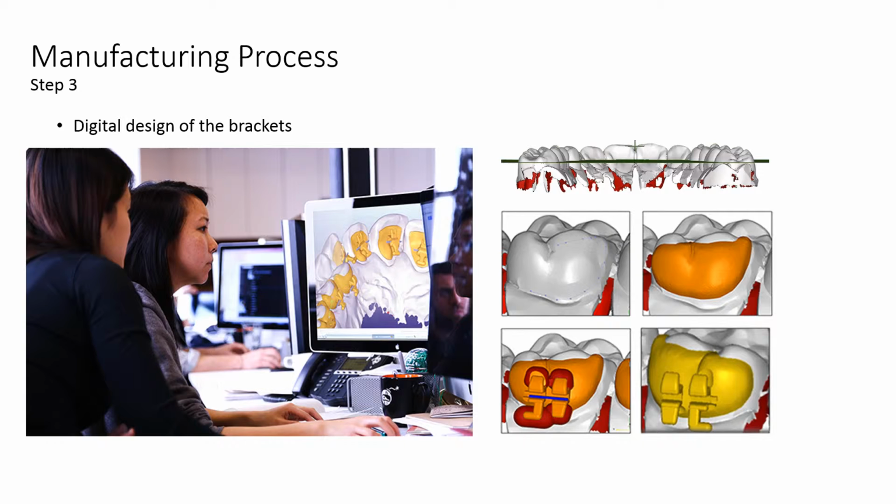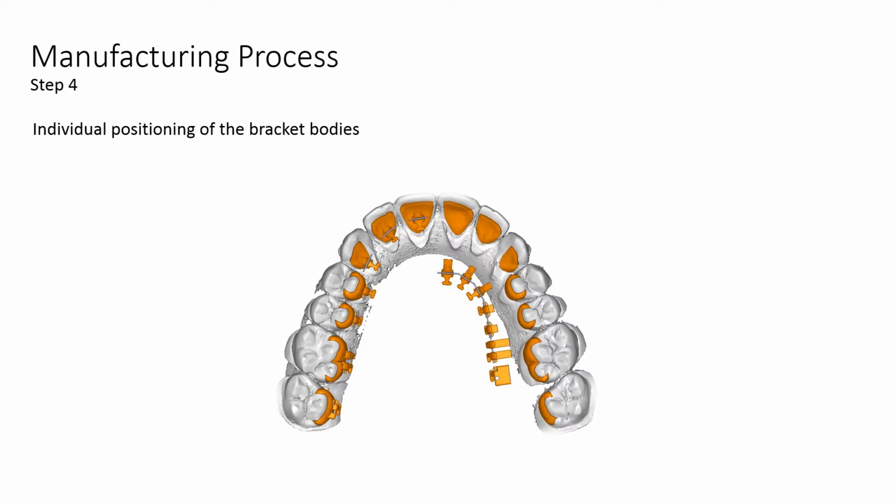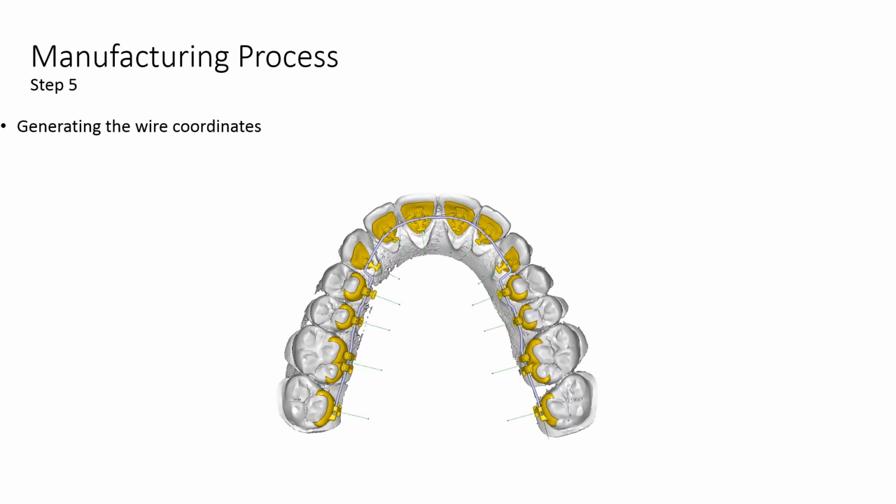You can get any kind of design because they will print it nowadays and then cast it. When they design the bracket base, they design the bodies on these bases individually to your needs: a tube with easy insertion, long tube, short tube, button, a bridge, or a splint. This is the next process in the manufacturing.